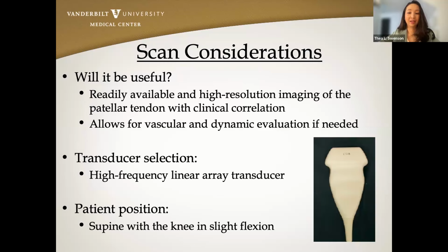For these exams, we use a high-frequency linear transducer and position the patient supine with the knee in slight flexion, about 15 degrees, using either a towel or other prop under the knee.